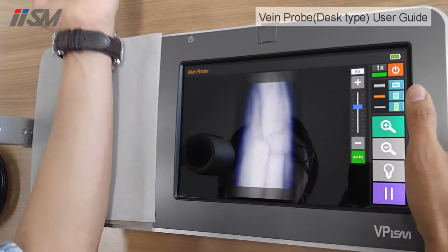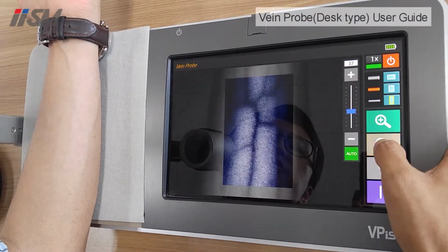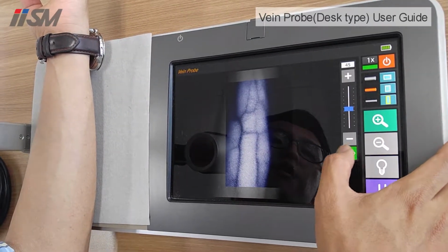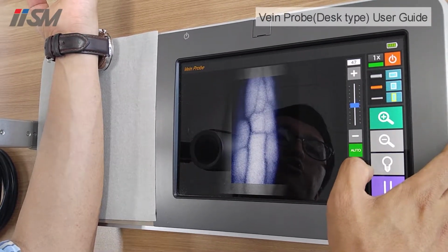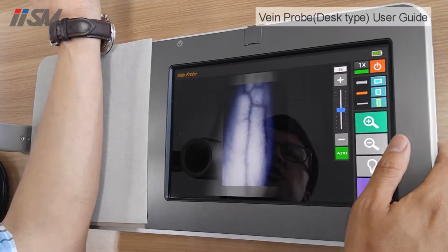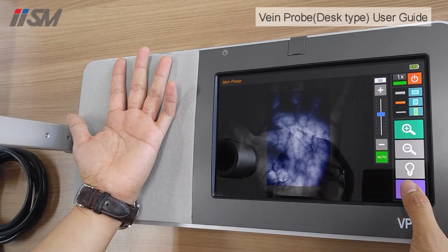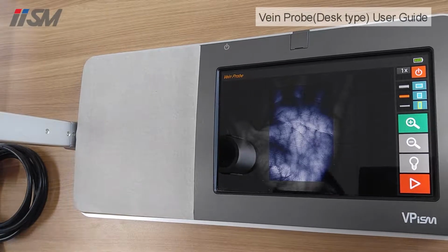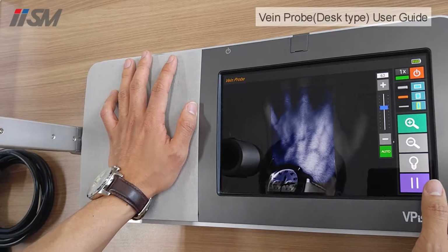Okay, so there are also other options like zoom in and zoom out. You can also refer to the manual for the details. This button is for the brightness control. Right now it's on automatic mode, so it's automatically adjusting the brightness, as you can see here. Here we also have the pause button, which works to freeze the screen, and then you can start again by pushing the play button.